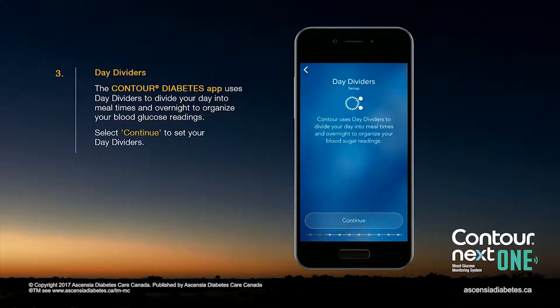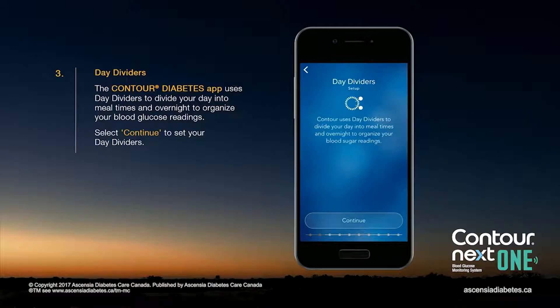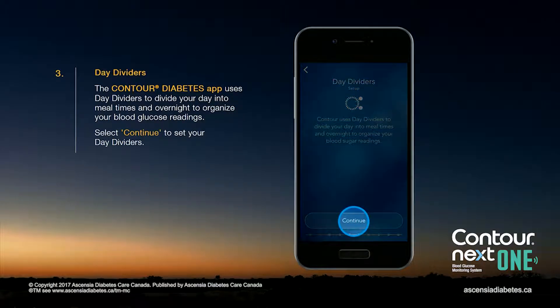The Contour Diabetes app uses day dividers to divide your day into meal times and overnight to organize your blood glucose readings. Select Continue to set your day dividers.